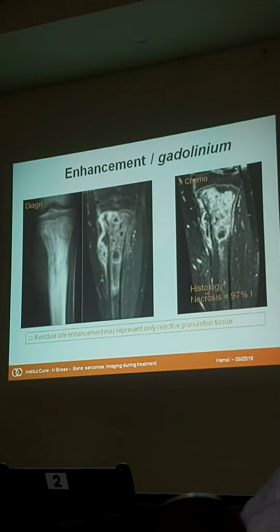What does it mean? It means that if you have a residual enhancement after the end of treatment, it may be related to the consolidation process because it is also vascularized. So it doesn't mean there is no response. So enhancement is not a good criterion to use.